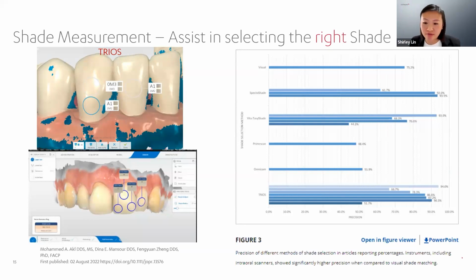Further development of these systems for clinical use is warranted and could definitely serve as a valuable tool for material selection and restoration design in aesthetic and restorative dentistry. But of course, you do still need to follow your regular protocols for shade taking.